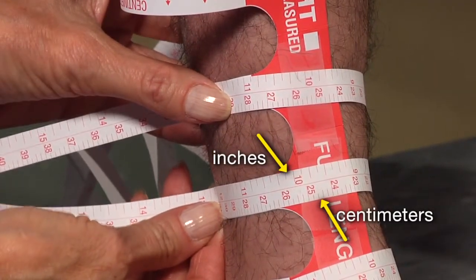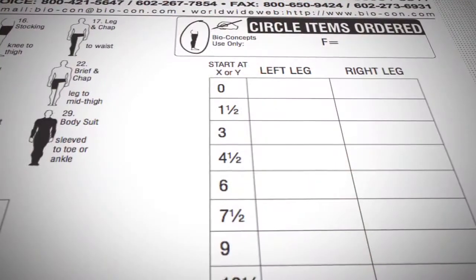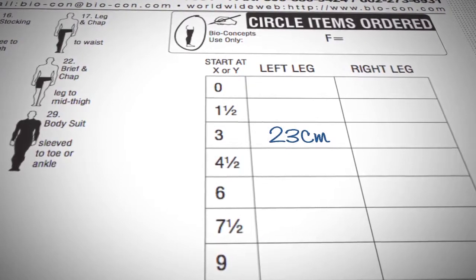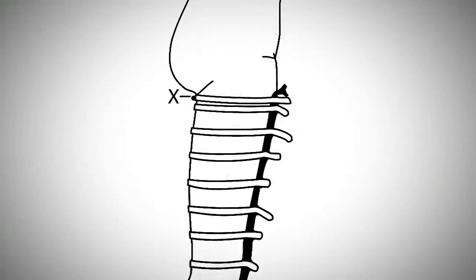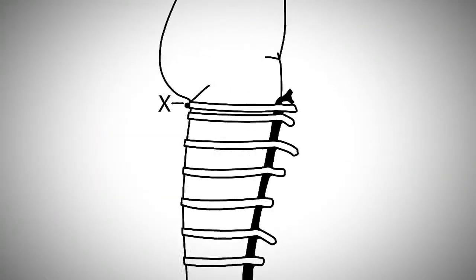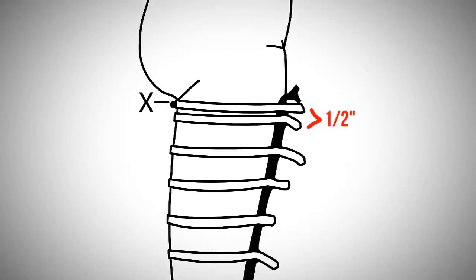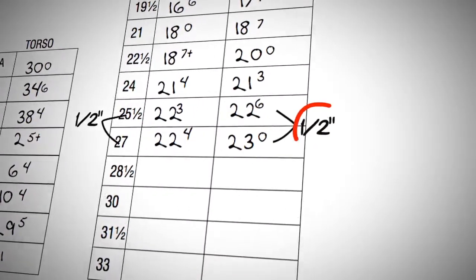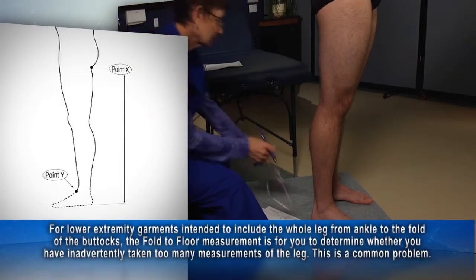Measurements are displayed in inches on the left-hand side of the strap and centimeters on the right. Indicate on the form which measurement system you are using. The top two circumferences may not be one and a half inches apart — in that case, measure the actual distance between the two and record it on the lower extremity chart.